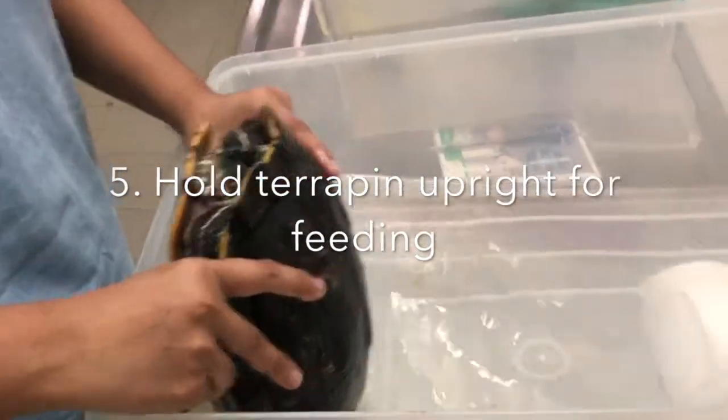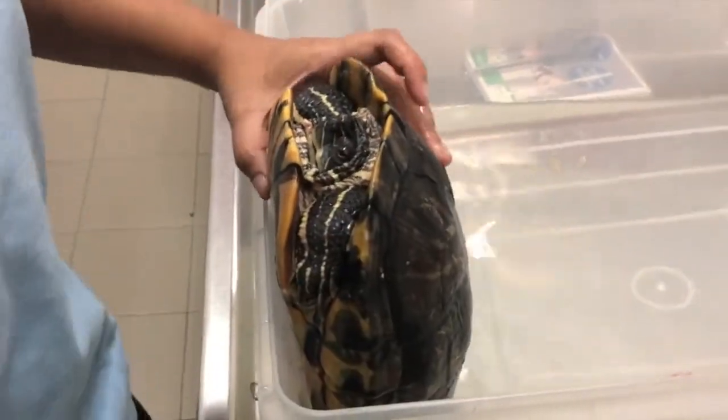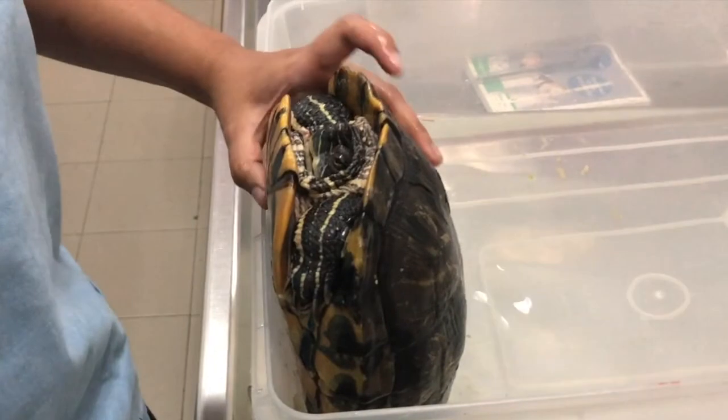Next, hold the terrapin upright to prevent it from moving. It is better to hold the terrapin at an angle of 45 degrees to prevent the terrapin from choking.